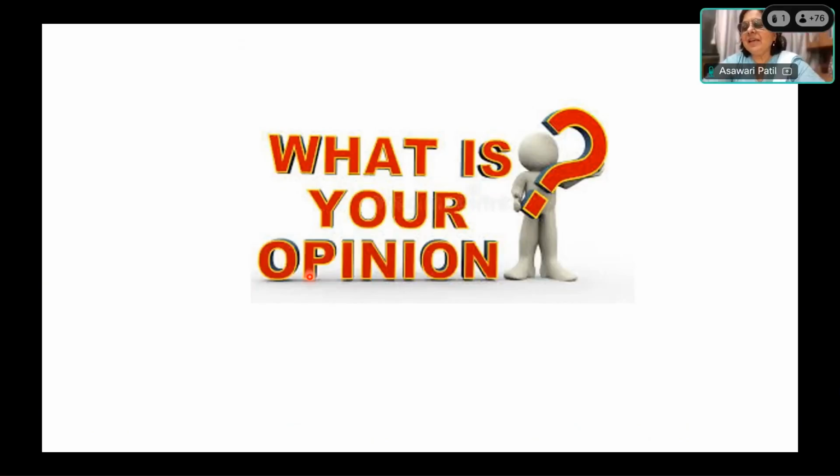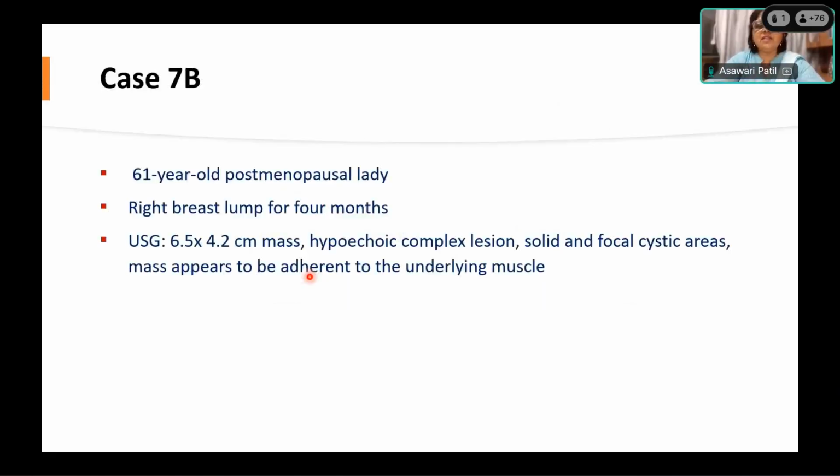See, now in this case, I would say it is a clear-cut fibroadenoma. It has no stromal heterogeneity, no increase in stromal cellularity. You look at the clinical features. It is well circumscribed. It is small. We don't see any atypia. So here, either you call it benign fibroepithelial neoplasm favor fibroadenoma, or you can clearly call it fibroadenoma. I wouldn't call this phyllodes tumor. This is not yet phyllodes tumor. Let's go to the next case and then we'll discuss together.